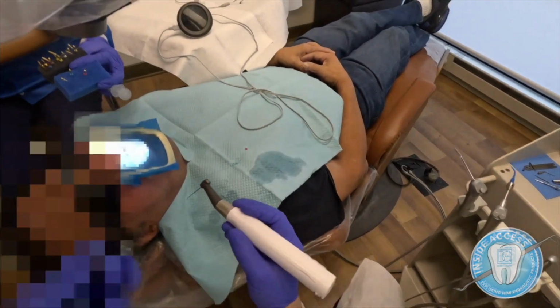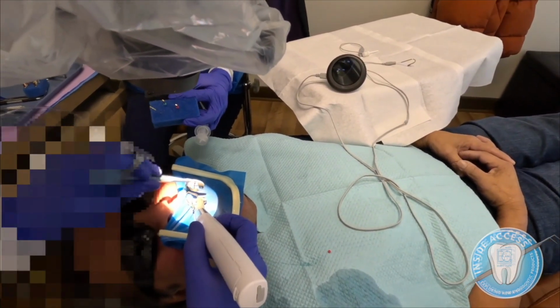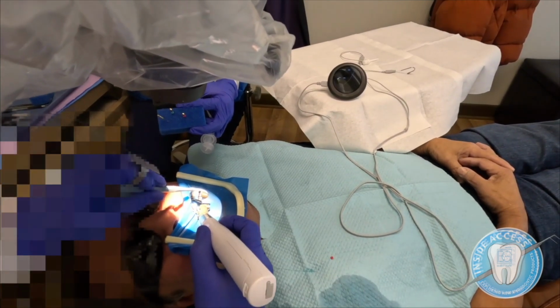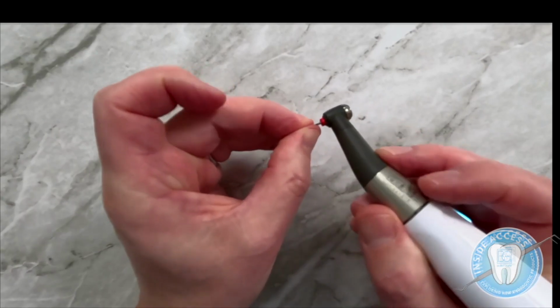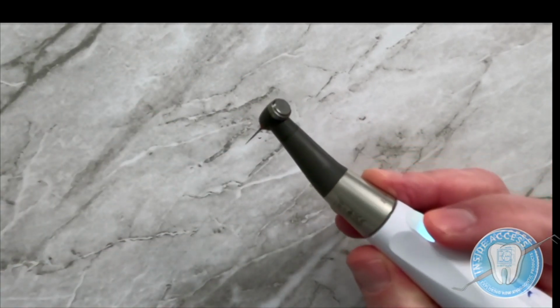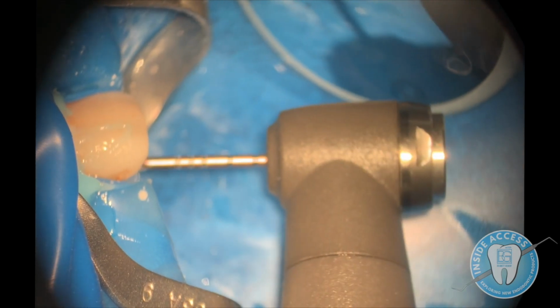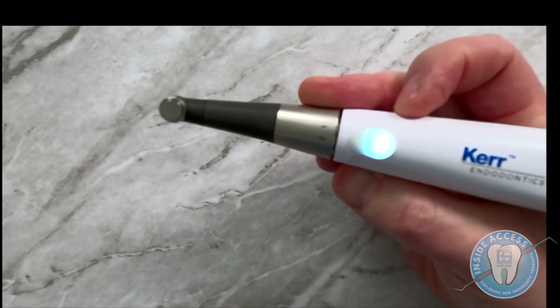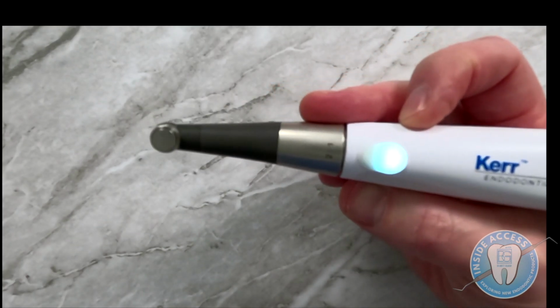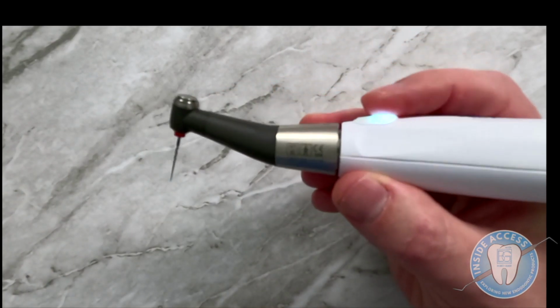And so again, it's a 30-degree clockwise, 150-degree counterclockwise, and I'm going to go ahead and add the file, and then you'll see, very nice, it's a very firm grip here on the contra angle. When I hit the button here, it's going to start spinning and doing the motion that is expected with the reciprocation motion. And again, you can see how it's blinking as well, and it's letting me know here on the screen where the torque is. And again, it's blinking, but that's where it is.